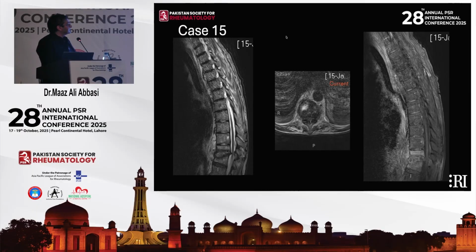Well, the first thing to notice is you're all right. This is a discitis, so that's very good. So why is this IVDU discitis? Well, the disc is completely destroyed. The end plates have collapsed and fractured. That is very characteristic, and it's a single level, okay? And there's a little bit of a prevertebral mass.